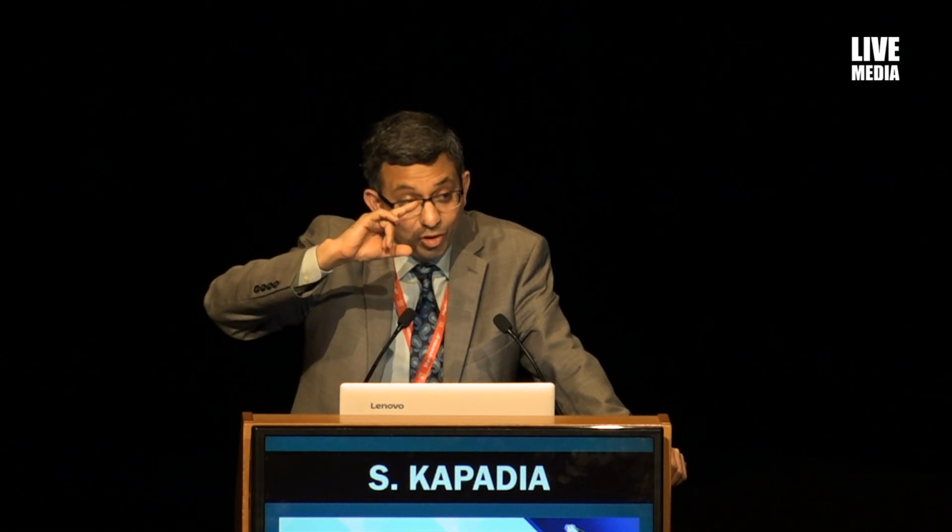For 2 years, in the next presentation I have some slides. We now have 8-year follow-up of some of the patients, and I'm going to show you another advantage of putting the valve high: the durability of the valve is better, believe it or not. If you put a balloon expandable valve that high, it is almost like supra-annular, so your leaflet thrombosis will be low and durability will be high.